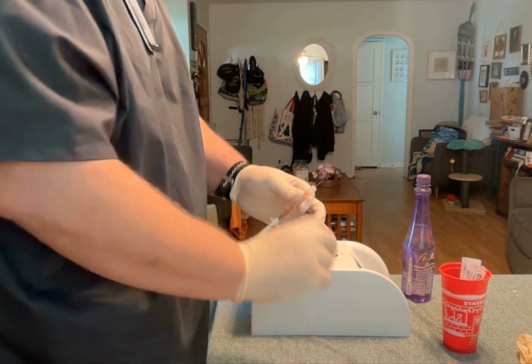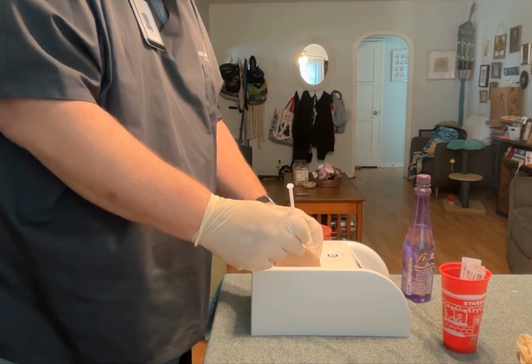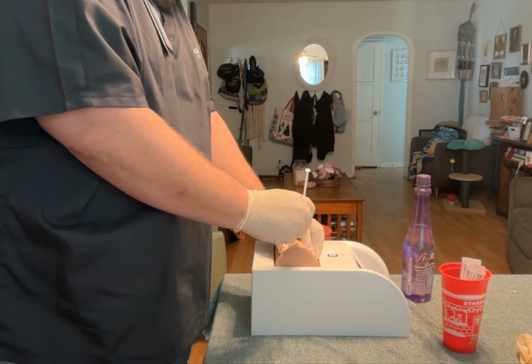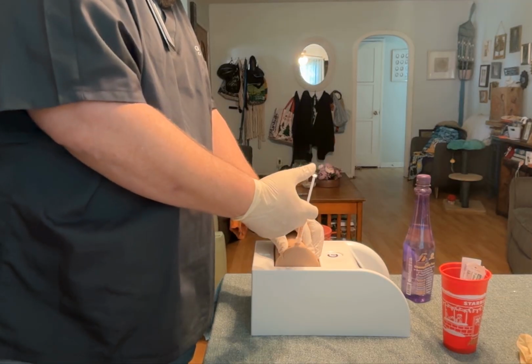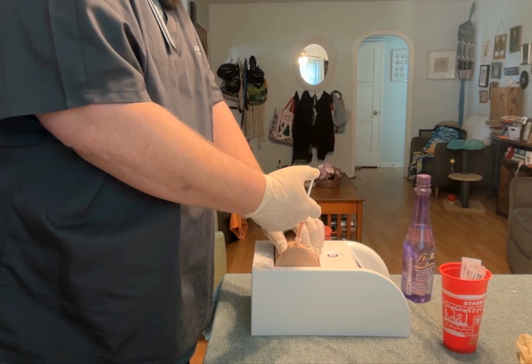So I'm going to take my needle cap off. I'm going to hold my needle like a dart, redo my pinch, and go in at about a 45 to 90 degree angle into the site. I'm going to inject, and I'm going to watch over a 30-second time, injecting 1 milliliter of heparin. Starting now.